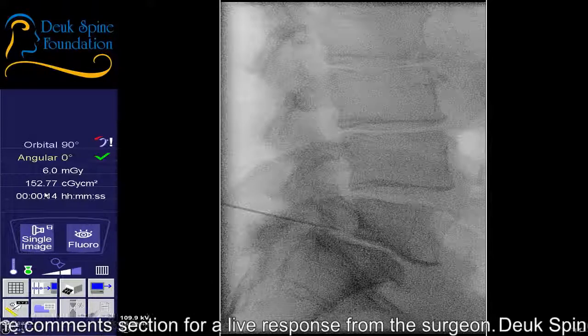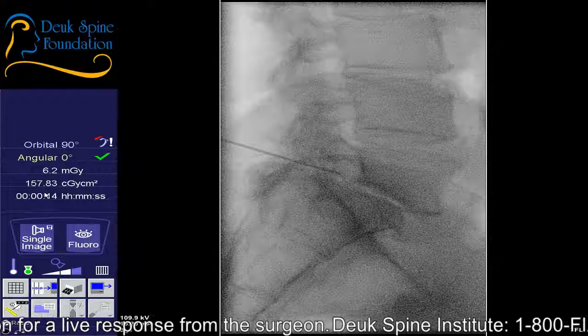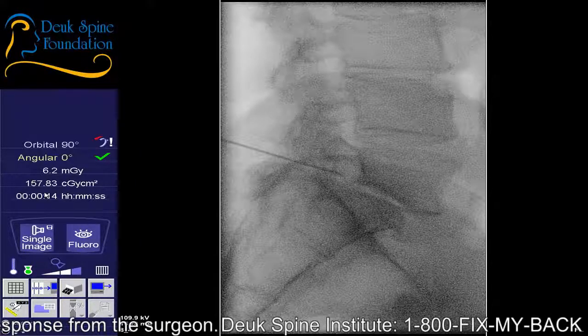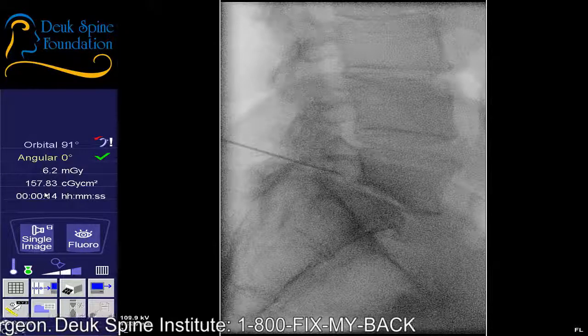Just wag one way or the other. Let's see if it gets better or worse. That was better, I think. It's hard to say, though. It looks better in some respects. It looks worse in some respects. Let me have the wag.